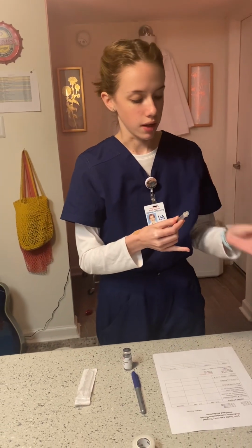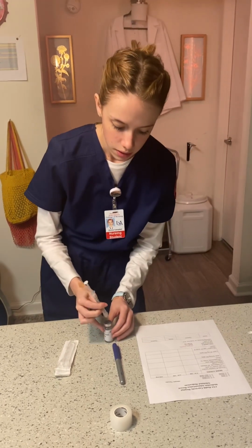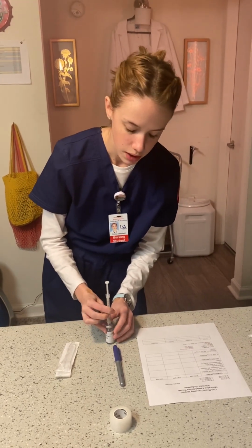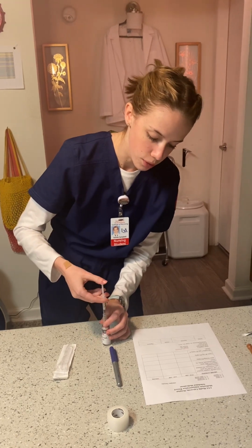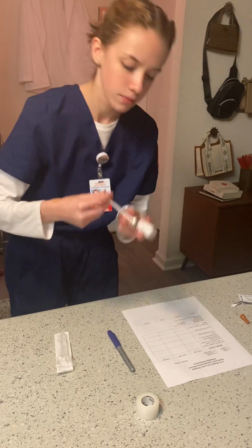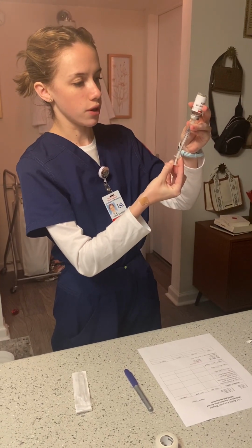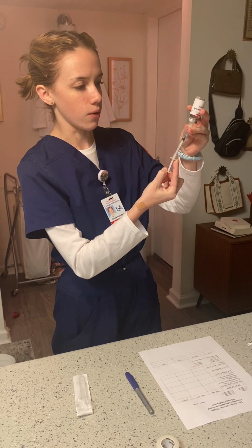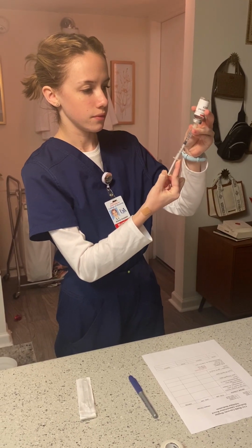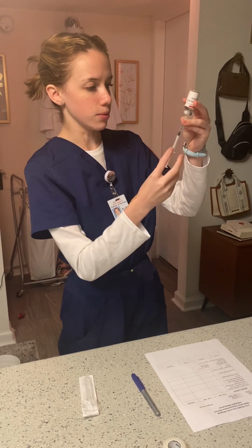I'm going to go ahead and uncap it. And I'm going to push the air into the vial. I'm going to pull this up and draw the medication out of the vial. And make sure you don't have any air bubbles.